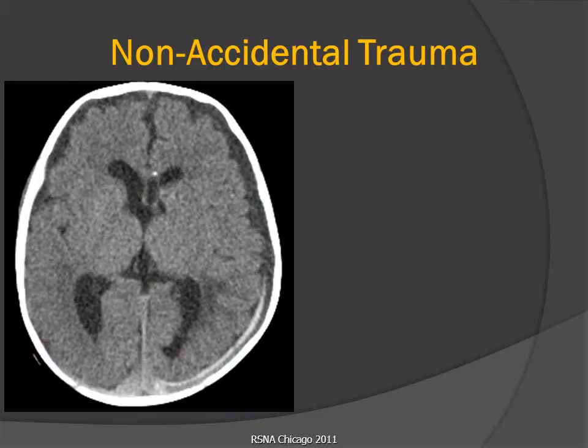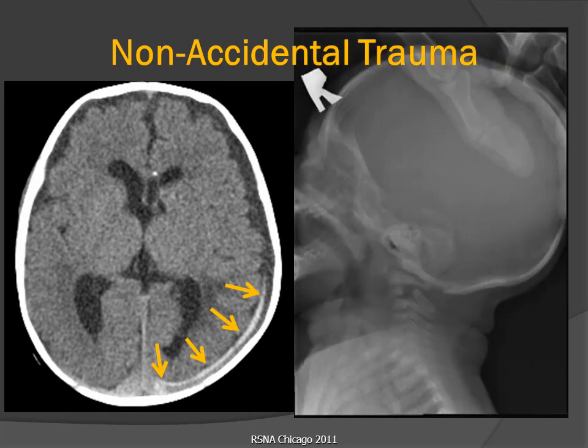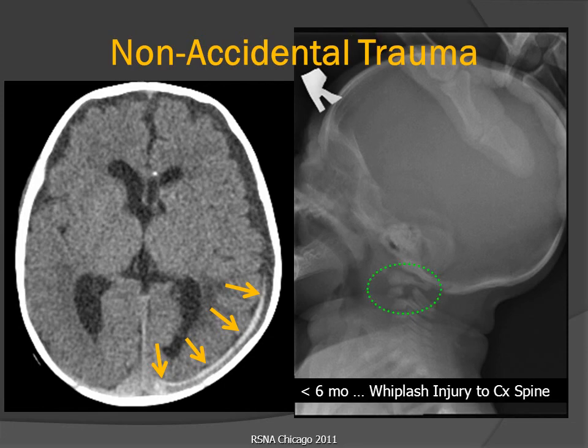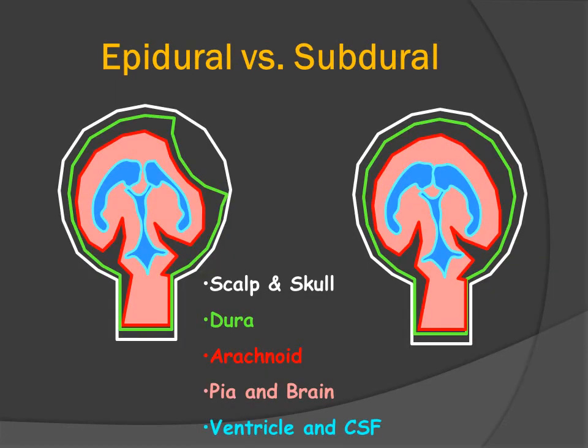This last image illustrates a child. We can see a thin layer of subdural blood overlying the occipital lobe on the patient's left side. This patient, who was under six months of age, also suffered from a whiplash injury and a fracture of the C2 vertebral body.